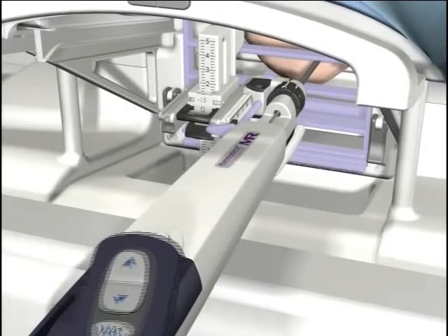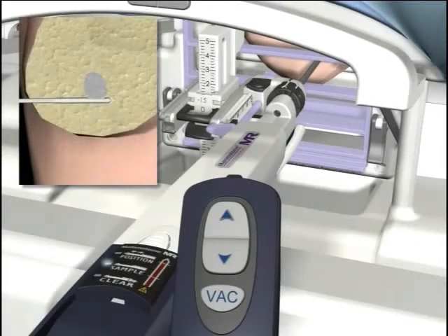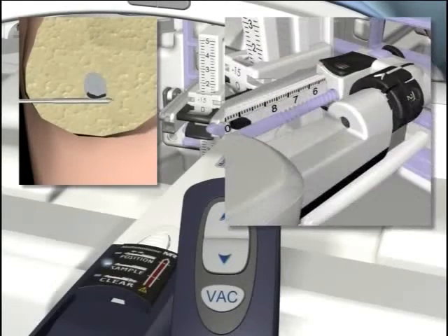Using the keypad on the holster, press the reverse button to retract the cutter from the needle sleeve. The position of the cutter is indicated on the holster by red LED lighting. Double click on the VAC or vacuum button to change modes. Then press the forward button to activate the cutter into the probe for sampling. When the sample is taken, the cutter automatically returns, placing the sample into the sample collection area where it is retrieved with MR-safe tweezers.